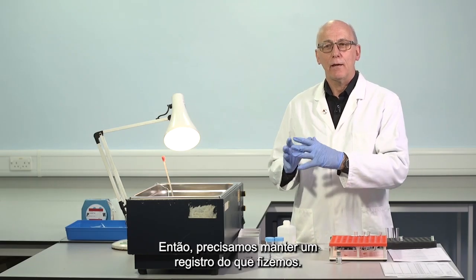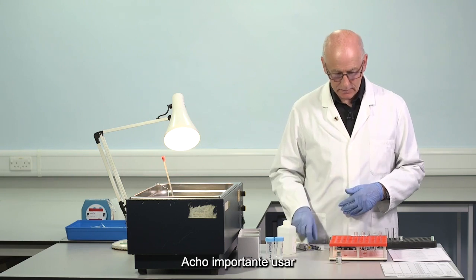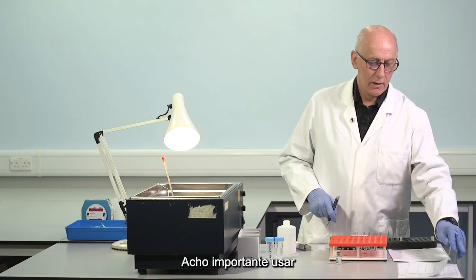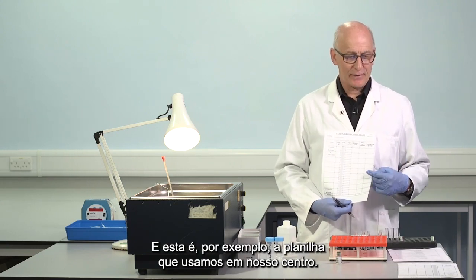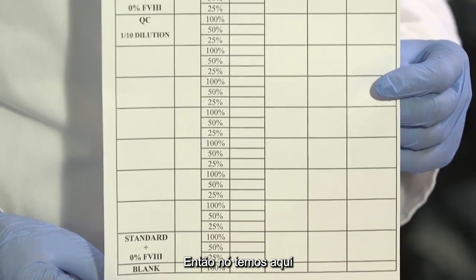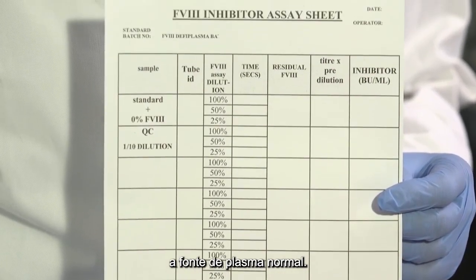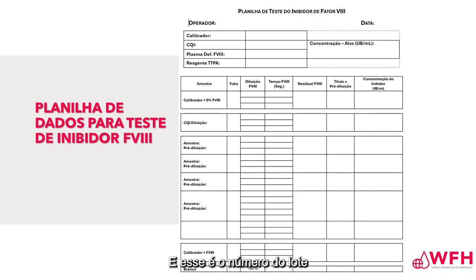So we need to keep a record of what we've done. I think it's important to use some kind of written evidence. And this is, for example, the sheet that is used in my centre. So we've got here the source of normal plasma. We've called it standard here, but it's the source of pooled normal plasma and its lot number. We've also got here the batch or lot number of factor VIII deficient plasma.